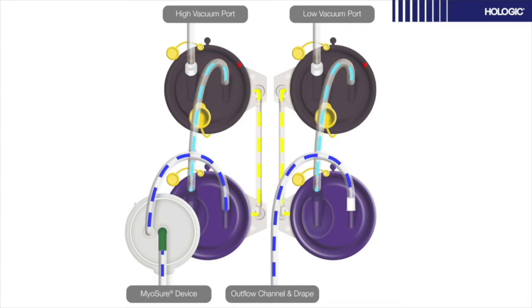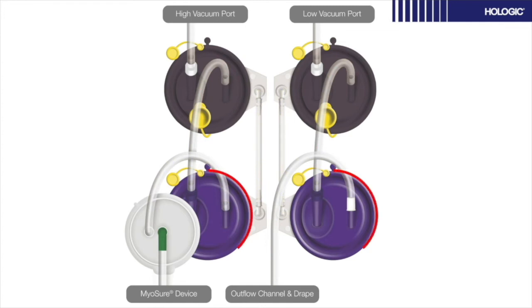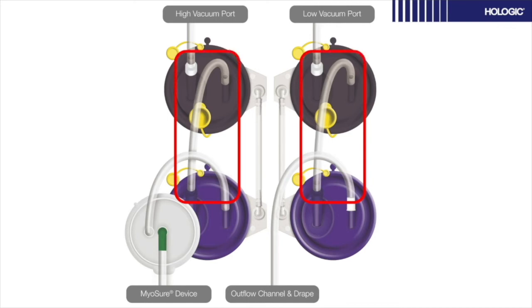The light blue arrows show the flow of fluid being suctioned from the front to the back canisters. If the front canister becomes full, it will flow into the back canister through the tandem tubing. Also note, for the majority of procedures, you will only need to replace two items: the front canisters and the tissue trap. You only need to replace the tandem tubing if it is used and the fluid cascades into the back canisters.